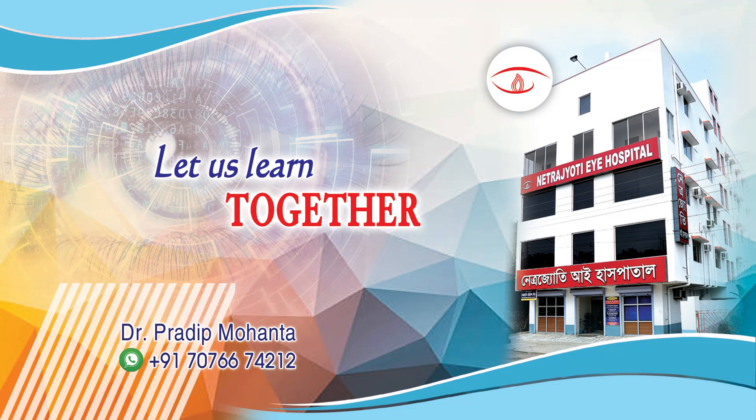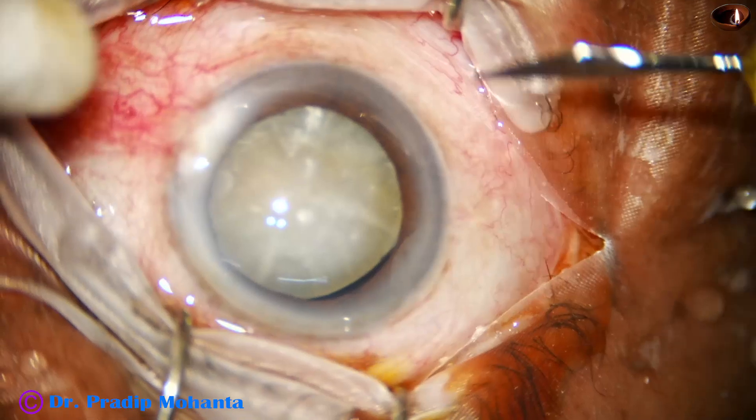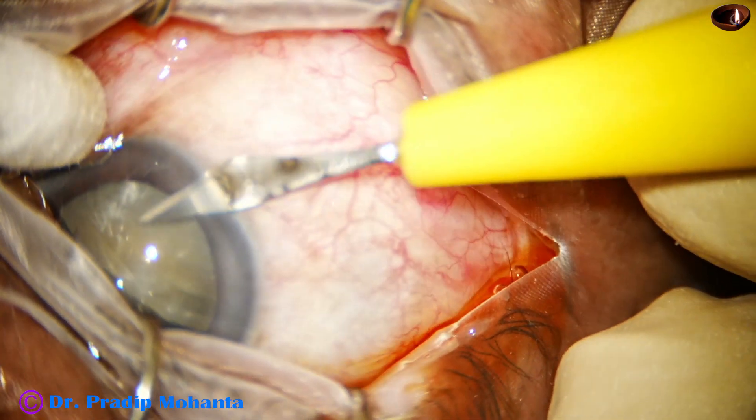Friends, welcome to my workplace at Ranaghat, West Bengal, India. Let us observe this minimally irritated surgery. This is a cataract with zonular dehiscence from 9 o'clock to 1 o'clock — 4 clock hours.